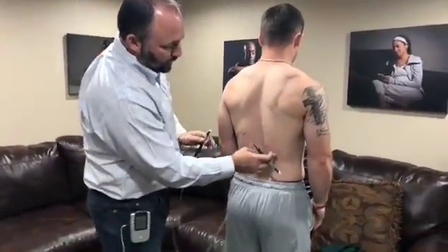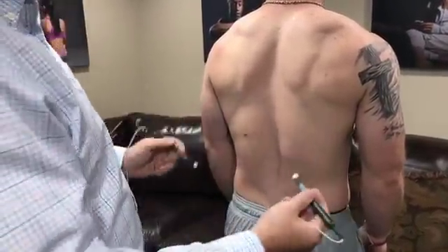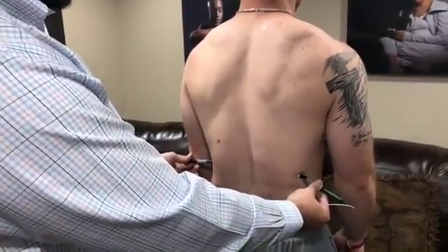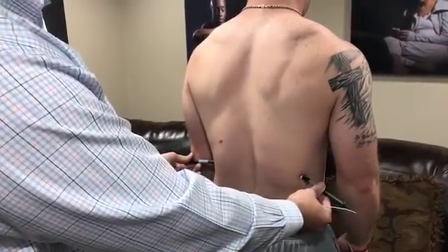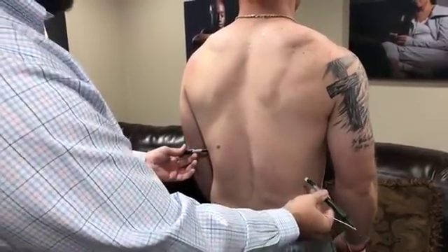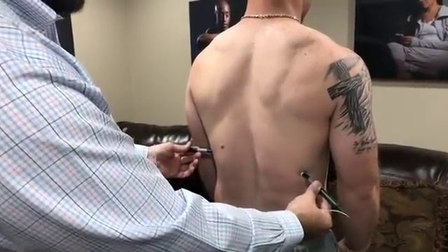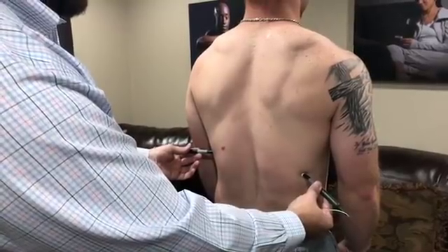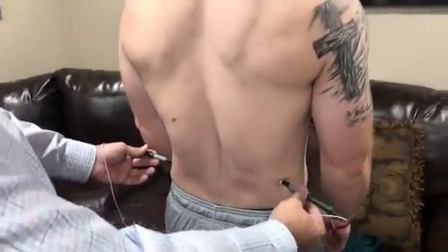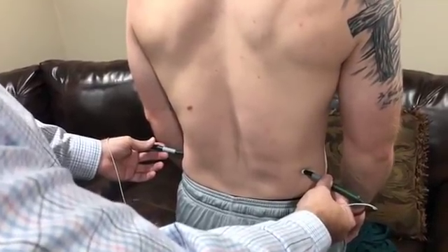You can see the spots where we treated our Xs — we treated through the pain, above it, and below it. Now we're going to do the same thing laterally, going side to side through Travis's obliques right where the pain is, then one level above and one level below. This is a generalization — it doesn't have to be exact. You don't have to be exact with your anatomy as long as you're directing that current through the pain. So we treated at the level laterally, went above, and now below — three spots right through his back. That concludes our basic protocol for the back.